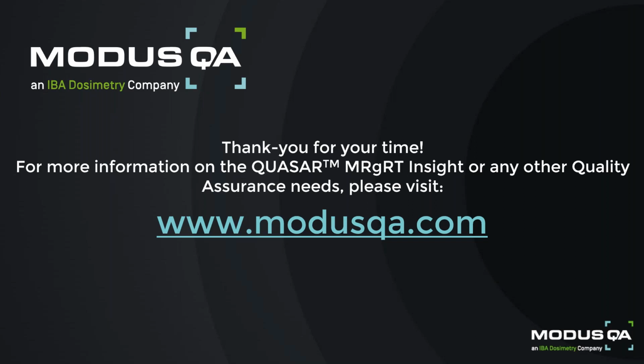Megan's question, will the Phantom inserts be visible and provide meaningful results for analysis using our standard TRUFI planning sequence on our ViewRay Meridian? Oh yeah, the Meridian, yes.